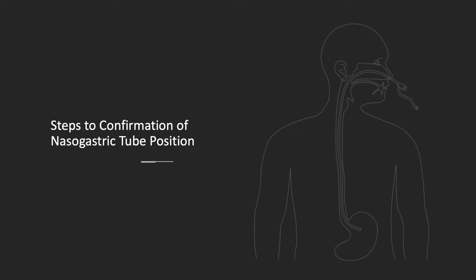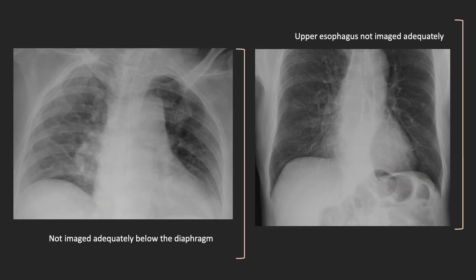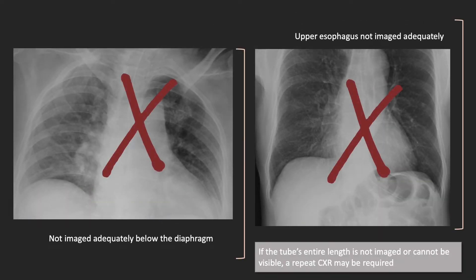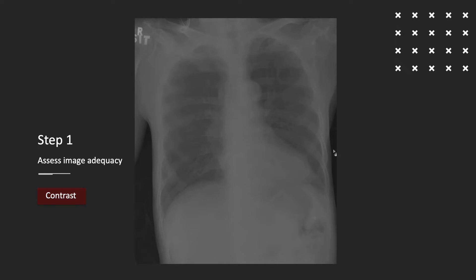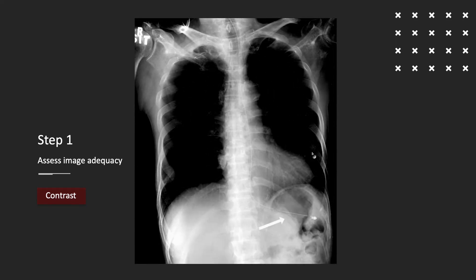Here is a step-by-step guide to confirmation of a normal nasogastric tube position. Firstly, determine whether the chest x-ray covers the adequate region of interest, from the upper esophagus to below the diaphragm. The tube should be clearly visible throughout its length, including to its tip. In some cases, you may have to manually adjust the window setting to increase the conspicuity of the tube.